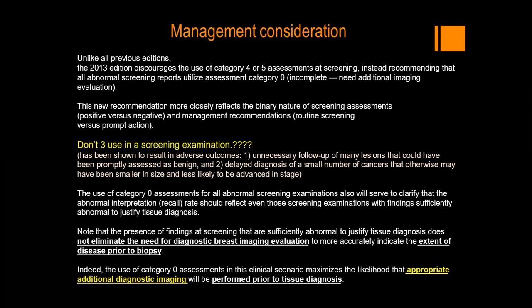Why are they using BI-RADS 0 even for lesions that are sufficiently suspicious to justify tissue biopsy? Because those lesions still need further workup for staging before taking a biopsy. They have done the further diagnostic workup indicated to determine the extent of the disease prior to biopsy.